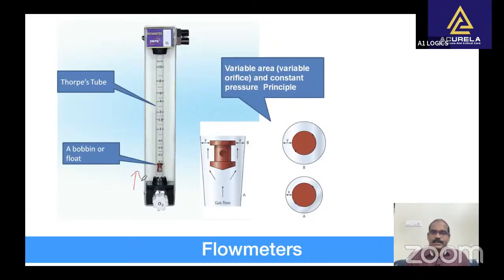Because the annular space is tubular at low flow rates, the flow is laminar and viscosity determines the gas flow rate and hence follows Poiseuille's law. The annular space simulates an orifice at high flow rates, and turbulent gas flow then depends predominantly on the density of the gas and follows Graham's law.